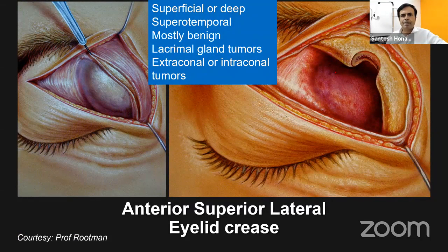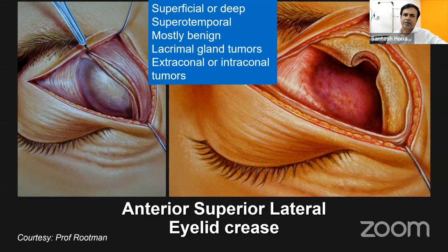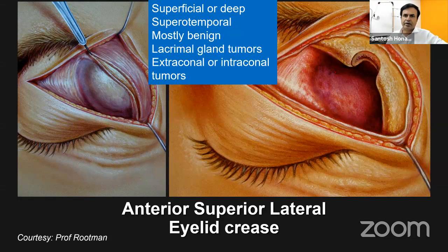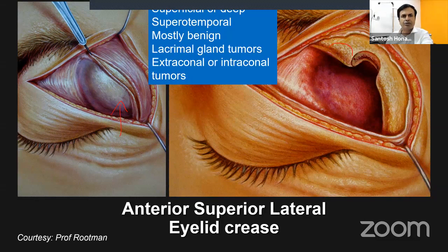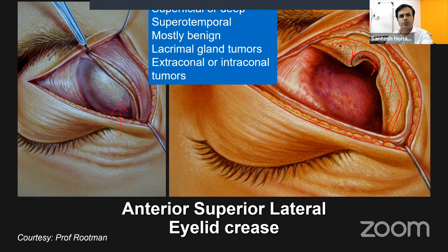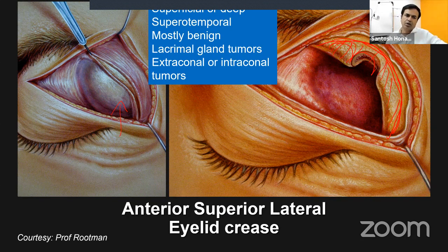The anterior superior lateral eyelid crease or direct approach can be used for superficial and deep lesions, extraconal or intraconal, and often without touching the bone at all. For deeper lesions, instead of a full lateral orbitotomy with bone cut, you can perform marginotomy — nibbling off the overhanging orbital margin with a burr or DCR punch to gain a deeper view into the orbit without a bone cut.